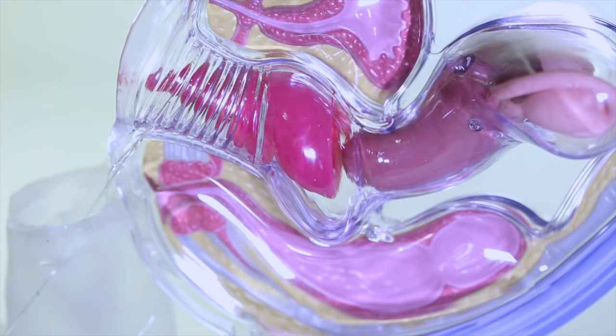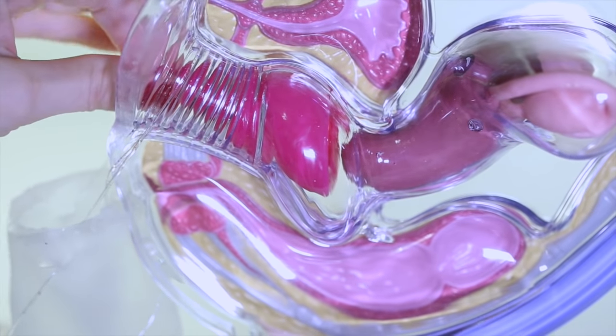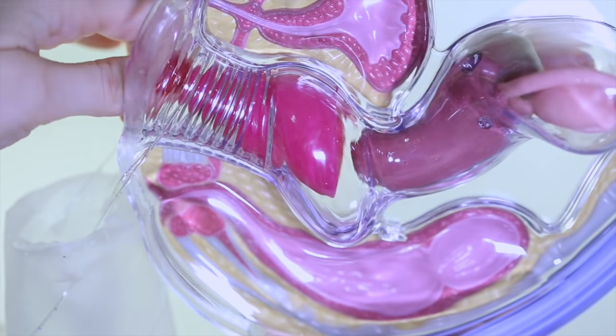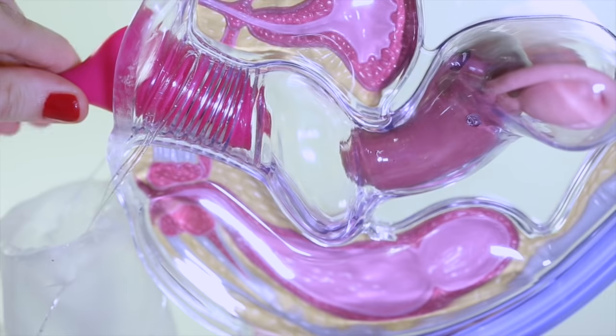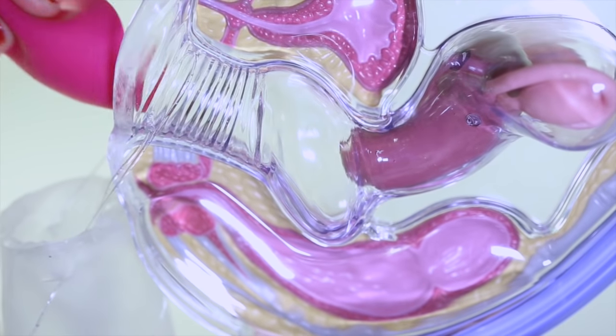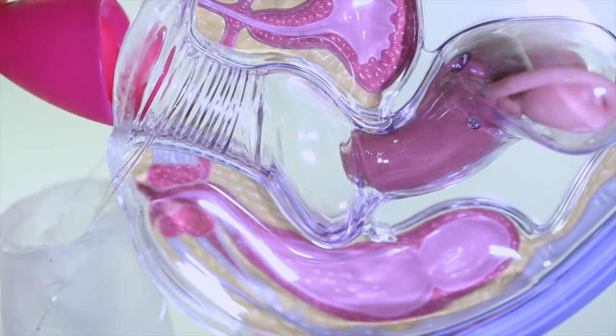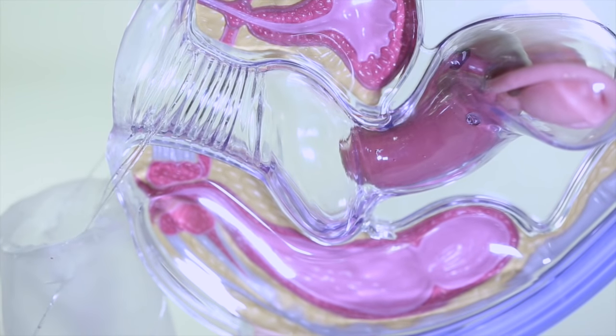If you bear down your muscles and move the cup down the vaginal canal to a place where you can reach it — depending on how short your cup is — just kind of walk it down. Then press, break the seal, and remove. We're doing this upright so it doesn't spill, but my model is sideways so just want to remind you of that.